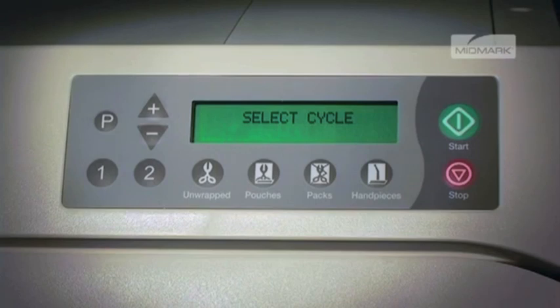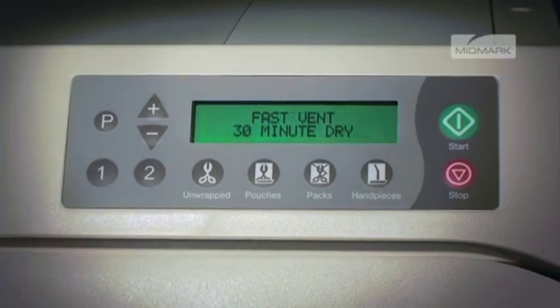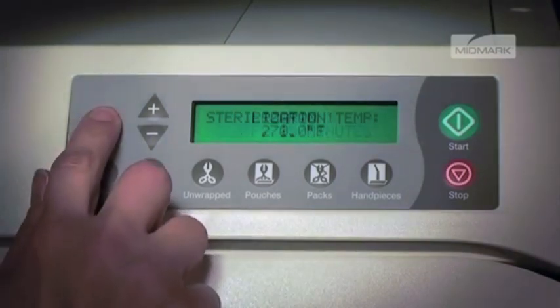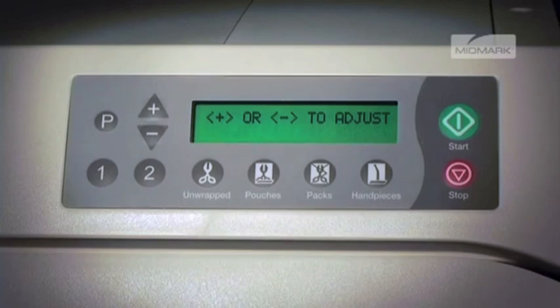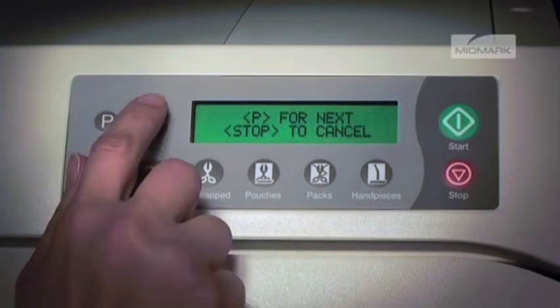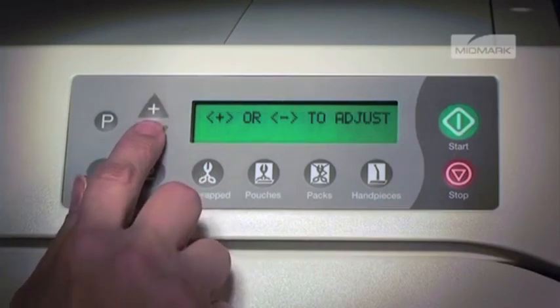For this example, we'll use Program 1. The display will show the current stored program and all cycle parameters. To reprogram, start by selecting the P button, and the display will show sterilization temp and the current value. Then press the plus or minus button to adjust, followed by P for next, or stop to cancel.